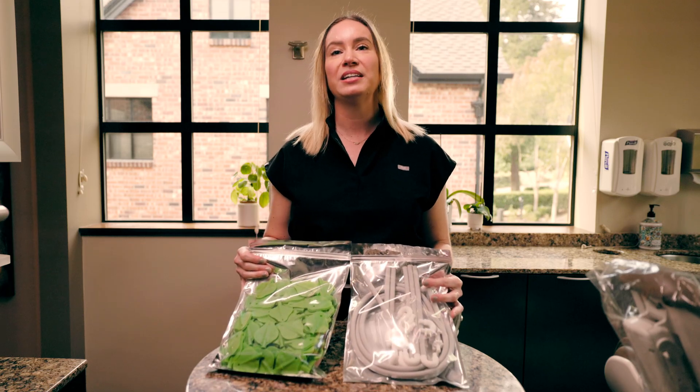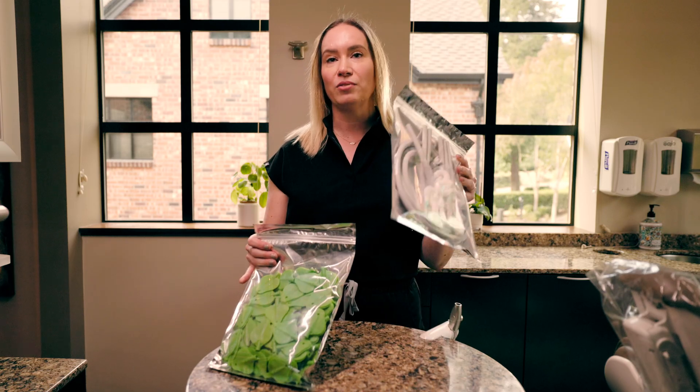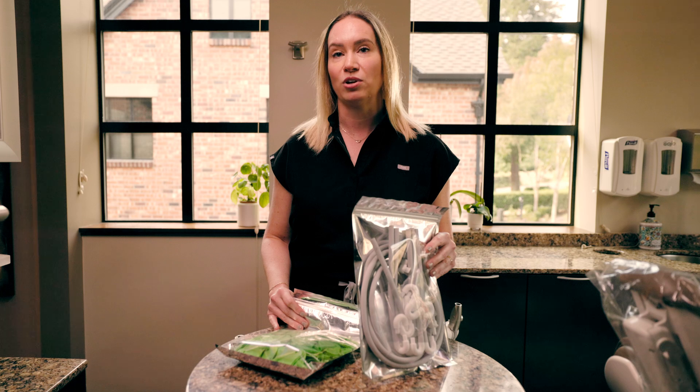Now that you've got your Relief standard kit, we're going to unbox, unwrap, and show you how to get it hooked up to your operatory.